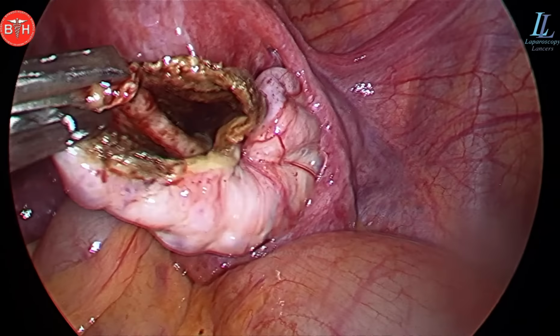You can see the bigger side I am trying to take it out. The Allis forceps pulling it toward one side and Maryland pulling it towards the other side. It may look a bit frustrating. Please don't worry. Keep continuing this dissection, as we don't want pieces of this endometriotic cyst remaining here.